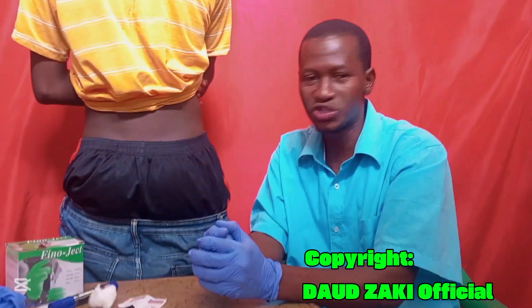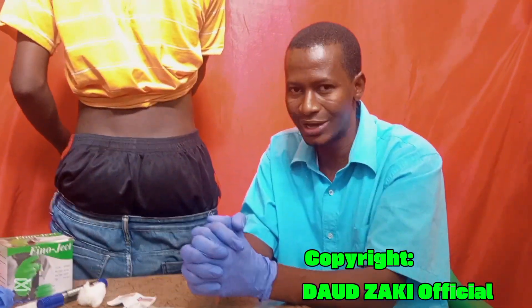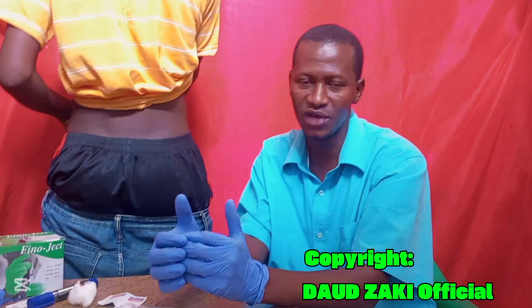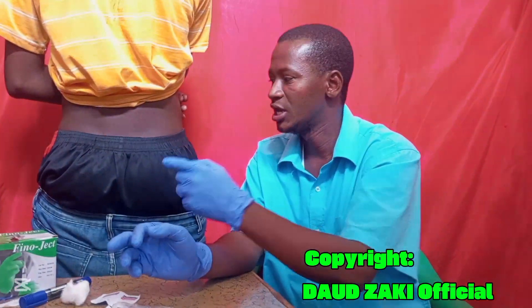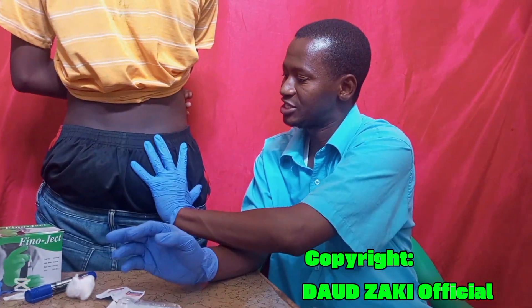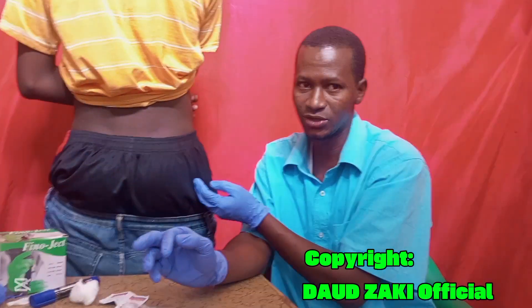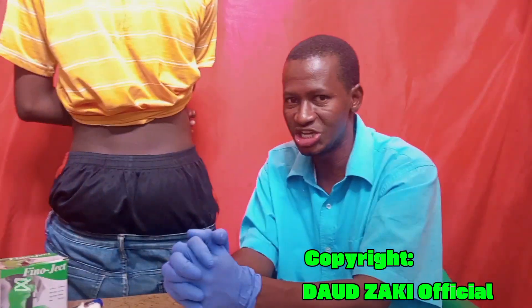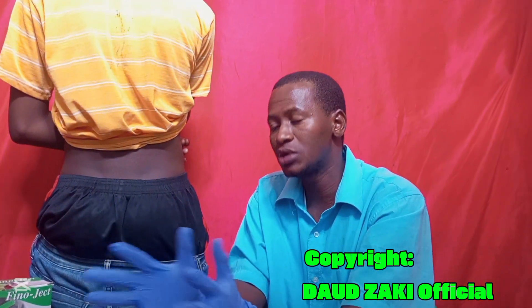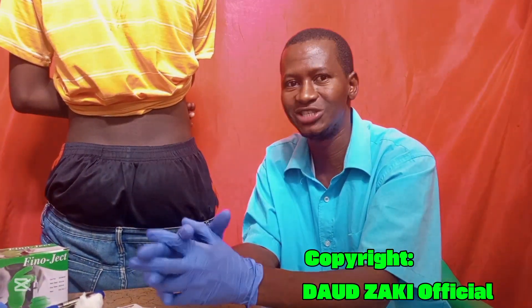I want to give you a simple trick to give the injection safely without causing pain or damage to nerve sites. There are three methods: the Z-track method, drawing an imaginary horizontal and vertical line, or placing your fingers on the site. You must be careful because there are sciatic nerves that can cause muscle damage and traumatic nerve injury, leading to long-term health problems.